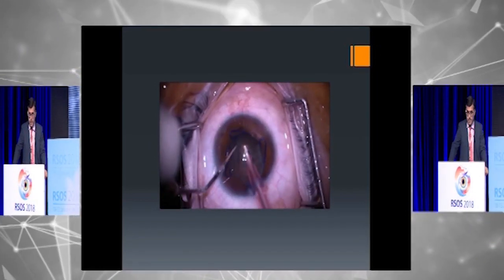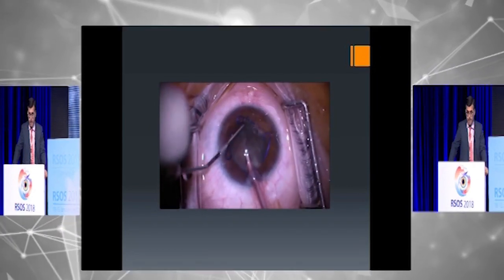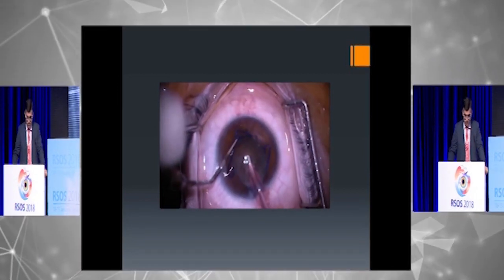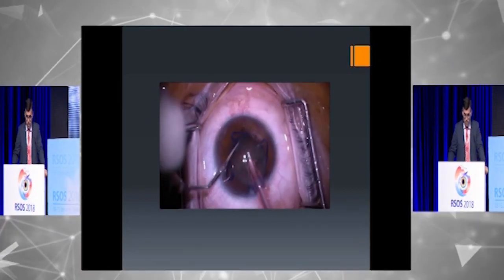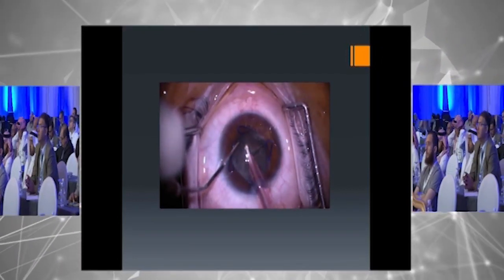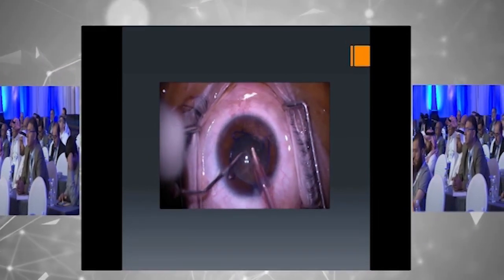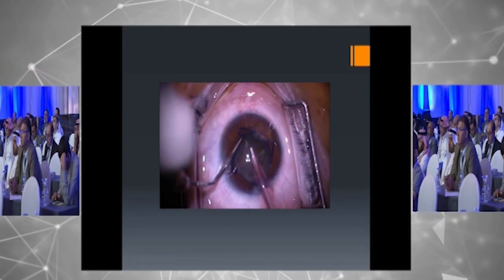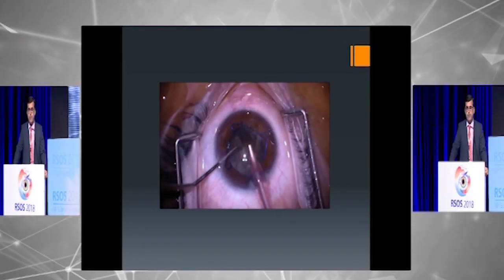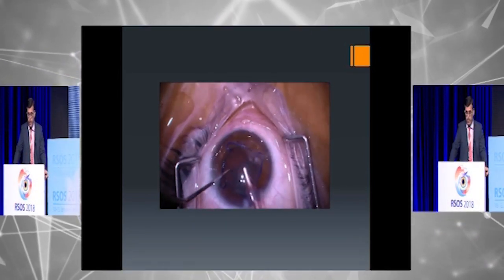The cataract was dense. Sometimes while removing this type of cataract, I prefer to use repeated injection of dispersive viscoelastic material to protect the endothelium of the cornea while doing the surgery.